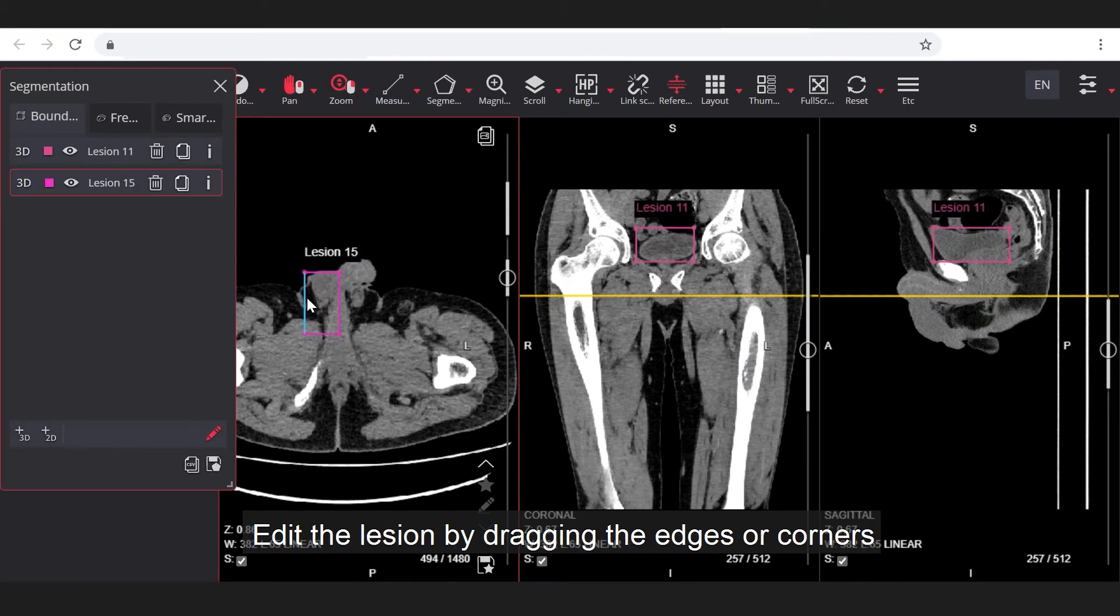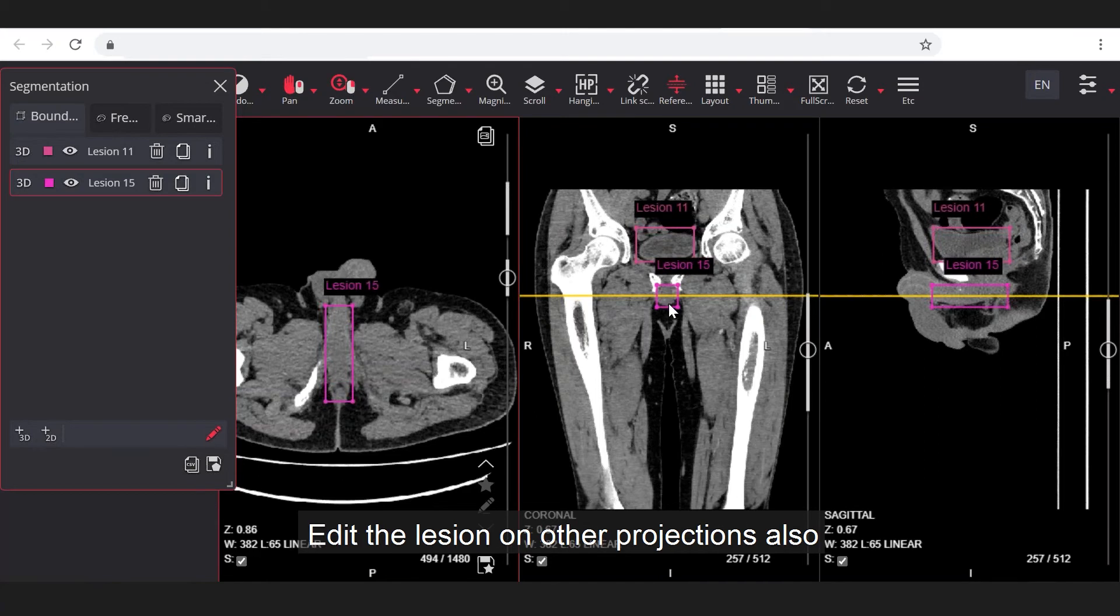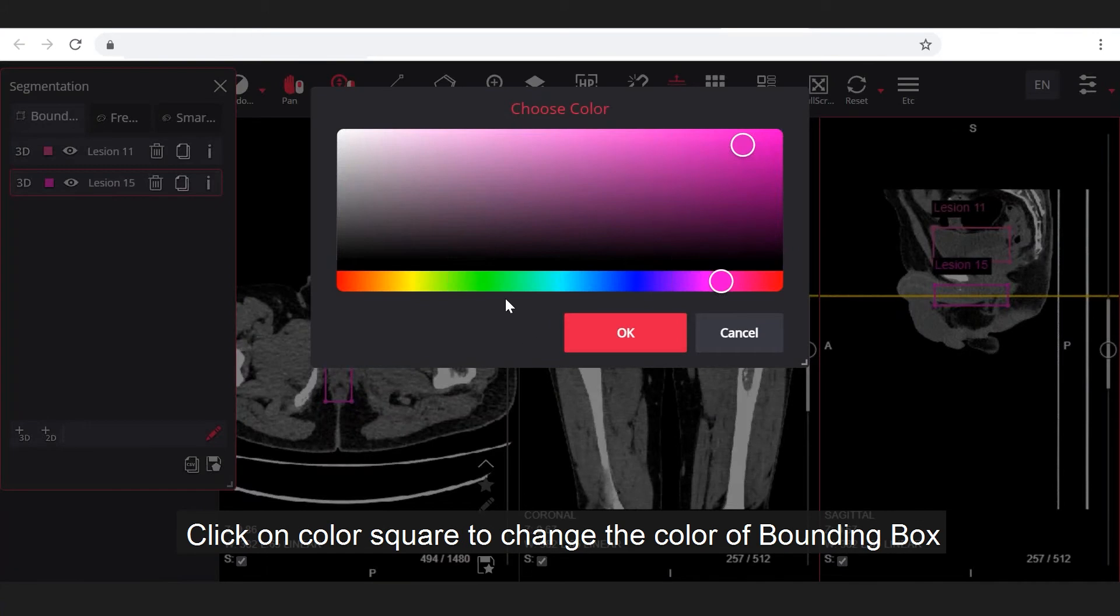You can edit the lesion by dragging the edges or corners and change position by dragging the lesion. You can also edit the lesion on other projections. Click on color square to change color of lesion.